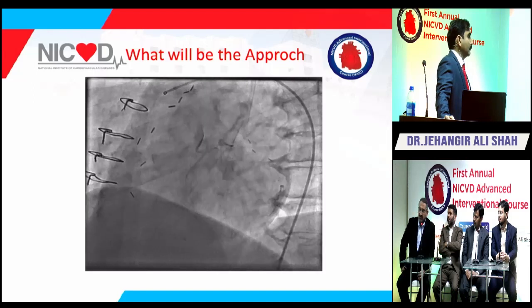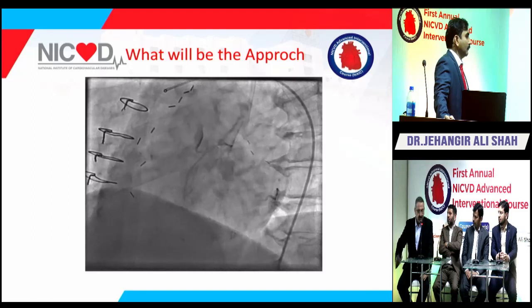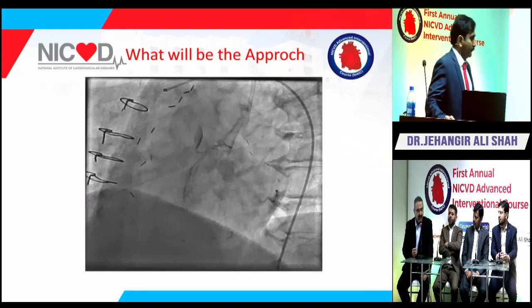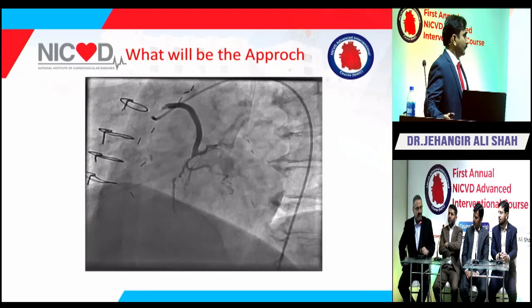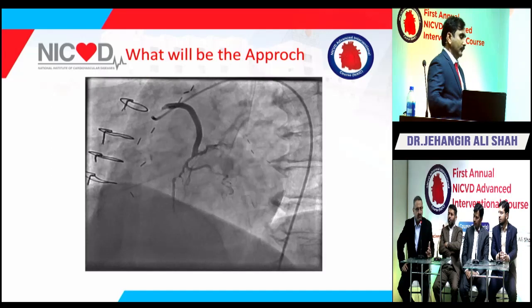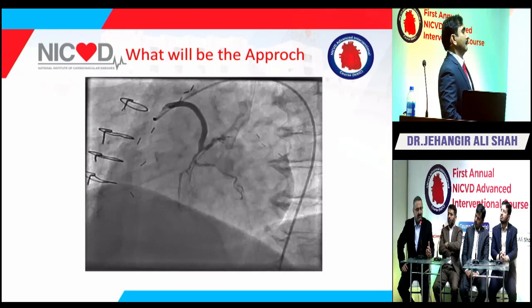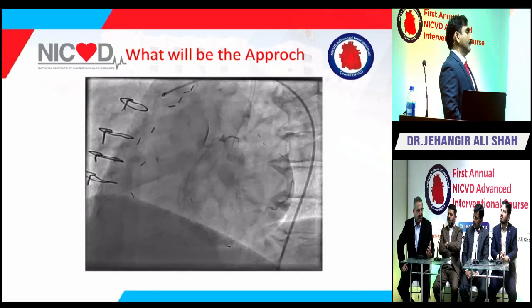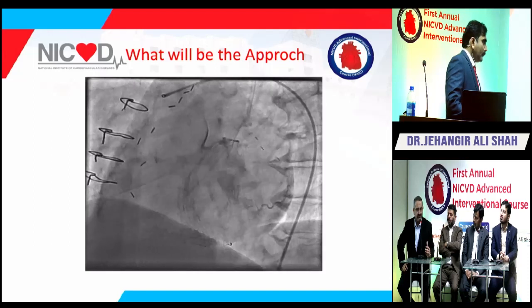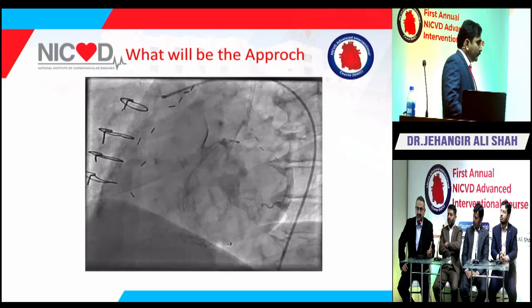And while you are stenting, the better method would be direct stenting, and secondly, an undersized, longer stent. Why? There is a specific reason behind that. If you take an oversized stent or a 1:1 stent, the problem is that there can be plaque prolapse through the stent struts. If you really want to avoid that, you have to take an undersized, longer stent. And then post-dilatation again should be avoided if possible.